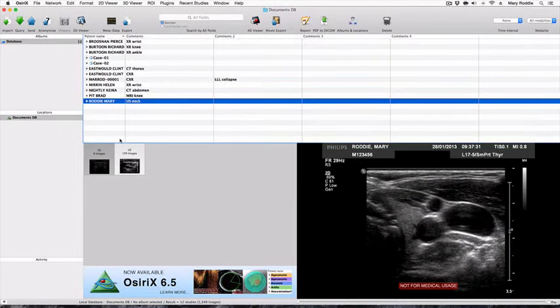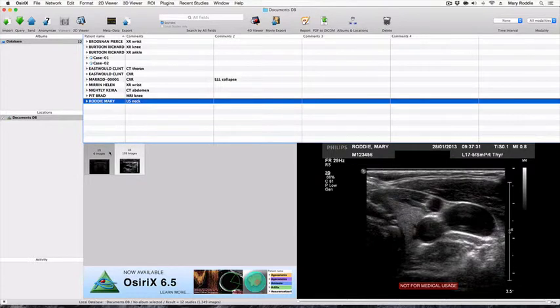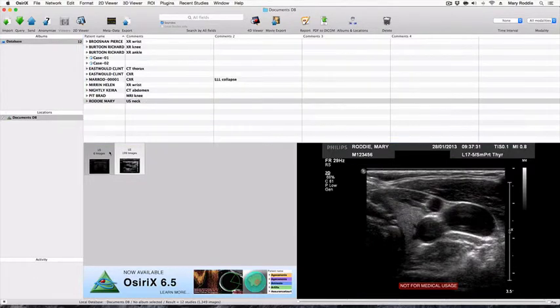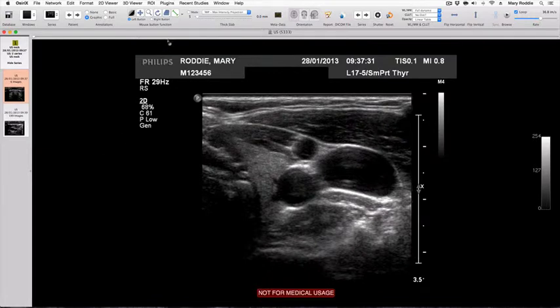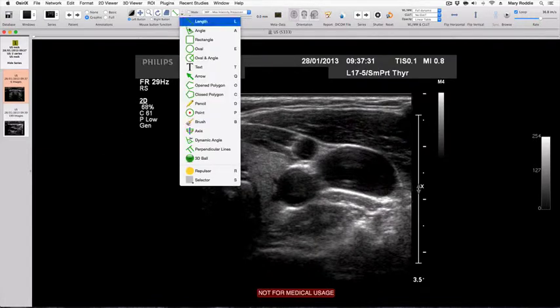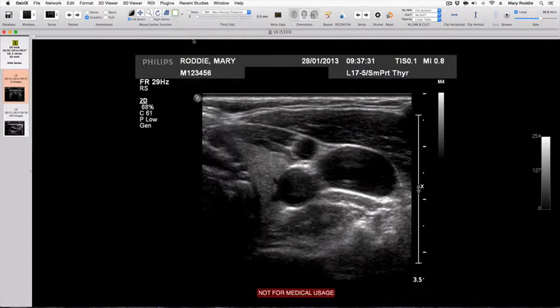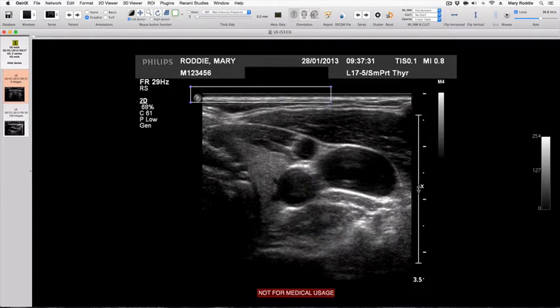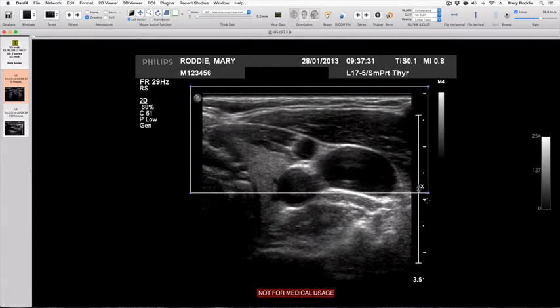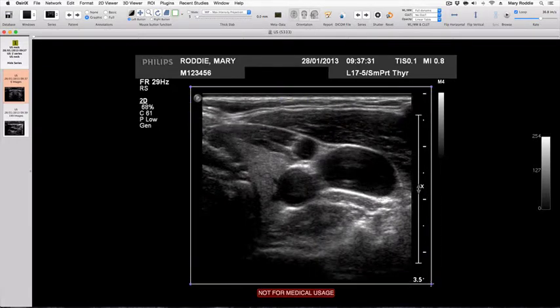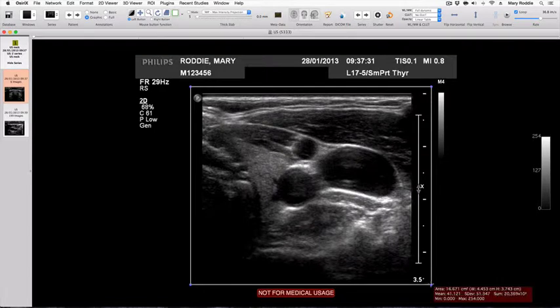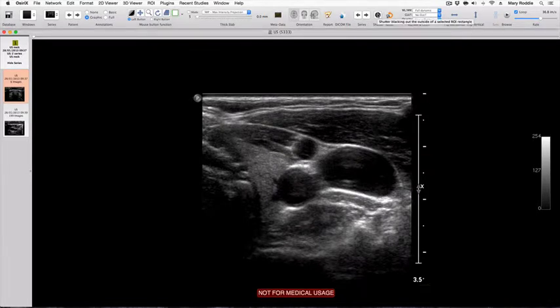For the first task, we will anonymize the series of six images. If we open them up, we need to select the rectangular region of interest tool. We then select the diagnostic part of the image and use the shutter tool to exclude the patient identifiers.